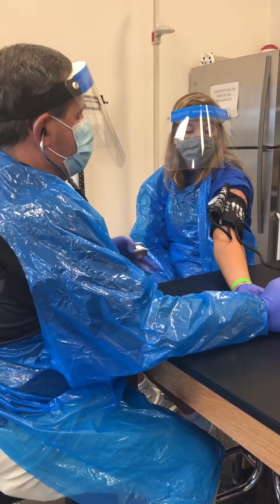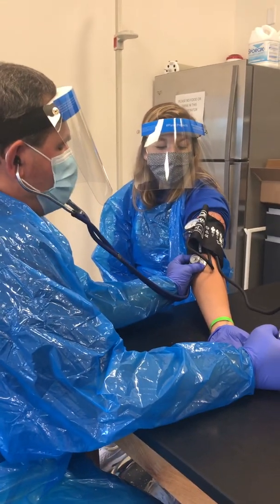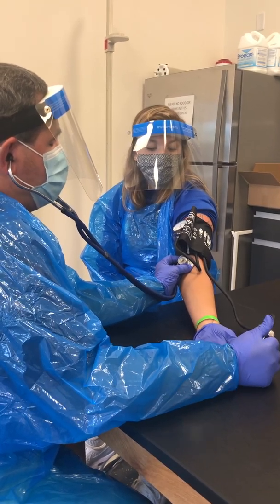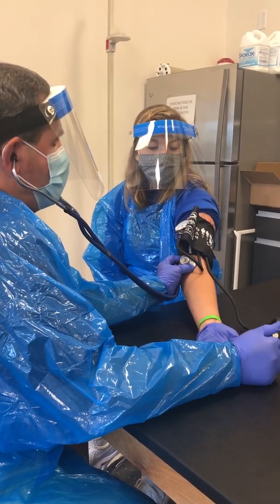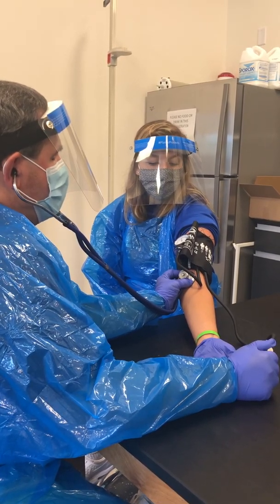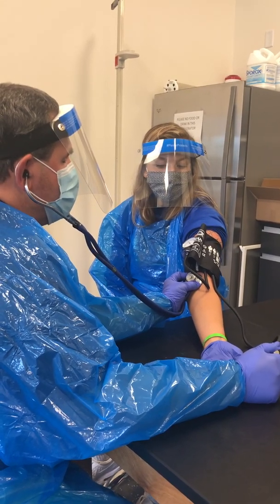above that point. I can now take the diaphragm of the stethoscope, put it directly over the brachial artery, again above the antecubital space but below the cuff. I'm going to retract back. I'm looking for 2 to 3 millimeters of mercury per second. I'm listening for the first of 2 consecutive sounds. That's going to give me the first Korotkoff sound.